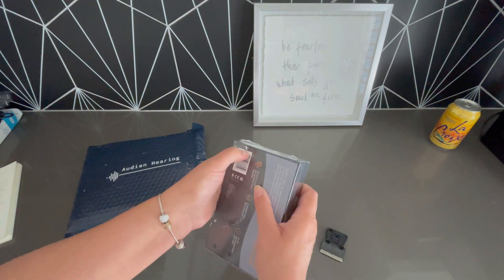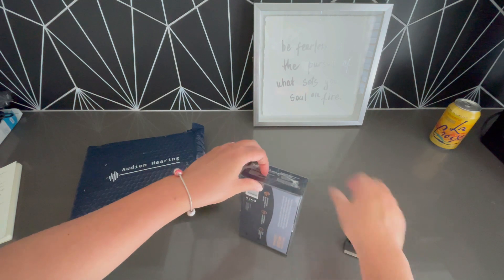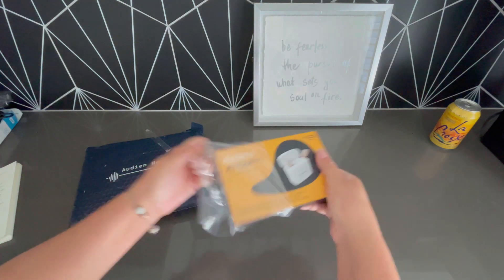So this is more of an unboxing video, but I will come back and let you know how they work. Let's check out what's in the box.